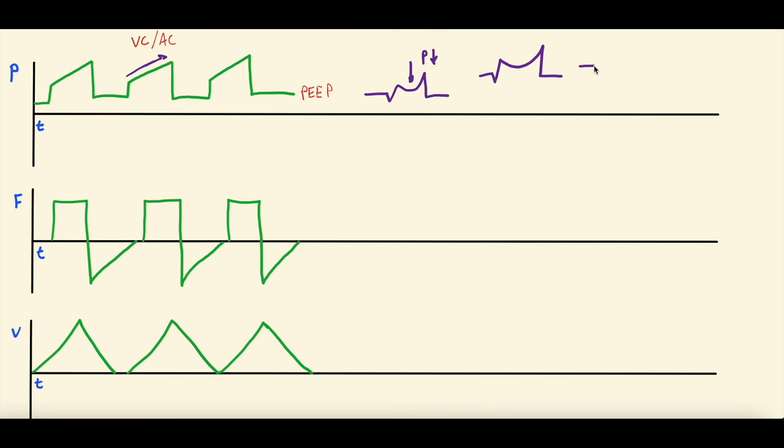This can get pretty severe. It can get to the point where, next breath, this can come way down before it goes back up. And this here would be flow starvation. The flow is not keeping pace with how fast they want the flow, so they are having a negative intrathoracic pressure because they're breathing in. They're sucking in through that endotracheal tube into their lungs. Their diaphragms are contracting, and it's happening faster than the flow is being delivered, which is why you get this negative deflection in the pressure scalar.